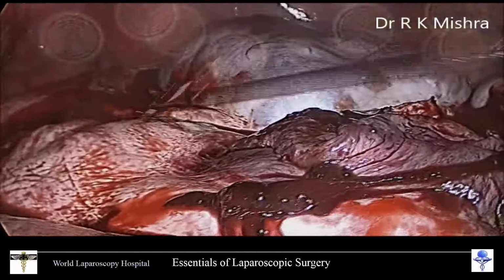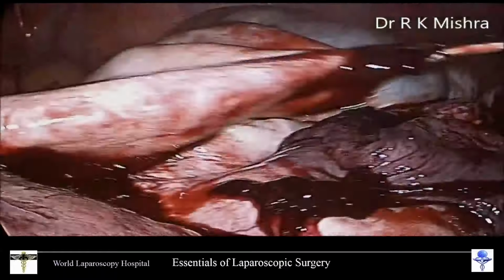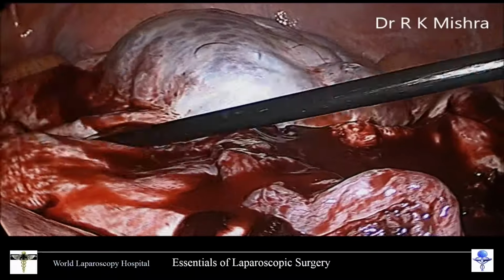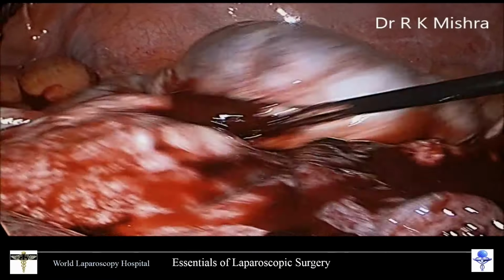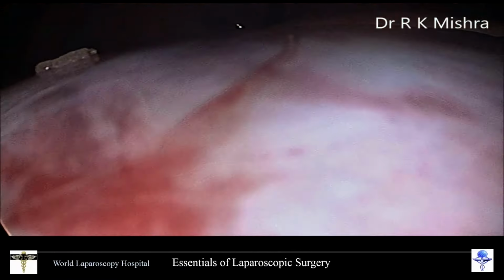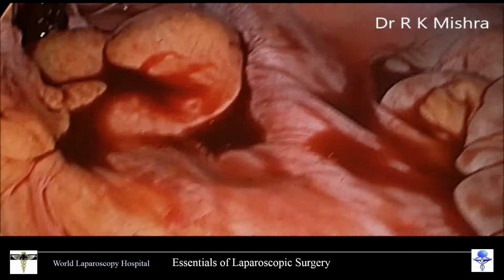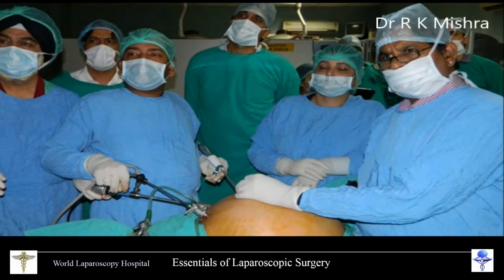Now it is done, and the entire abdomen is, as you can see, filled with the cyst only. In spite of collapsing it, it is difficult to pull it because everywhere there is cyst. Now you will drop the infundibulopelvic ligament.